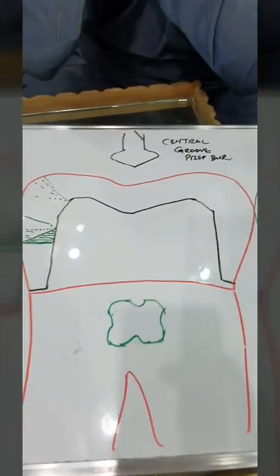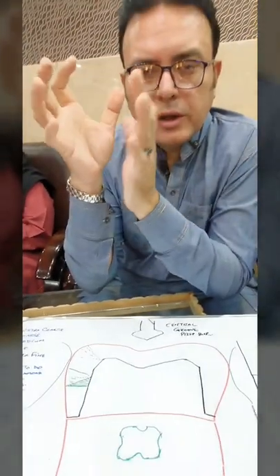For zirconia cementation, we do need to treat the tooth very well, clean it mechanically, physically. Then we also have to etch it and apply the adhesive layer to get the zirconia to adhere. But I would take the same precaution and same efforts in preparing the tooth for cementation when a PFM is involved. I would clean it with piezo. I would go ahead and also use hydrogen peroxide gauze, not too wet, slightly moistened, to clean the surface of the tooth to remove any buildup on it. The reason I would not use alcohol on the tooth is because alcohol is known to fix proteins onto the surface where you're cleaning it.